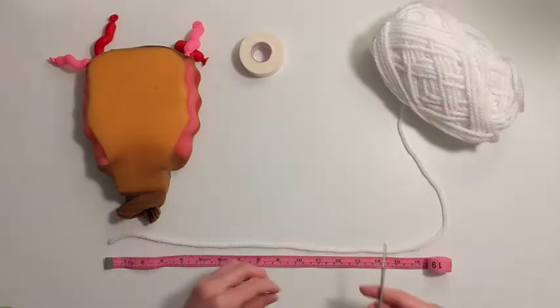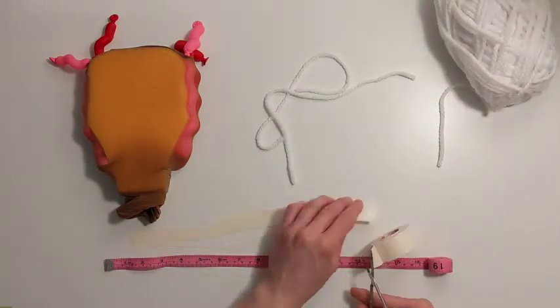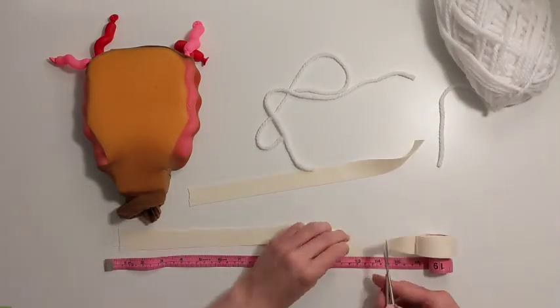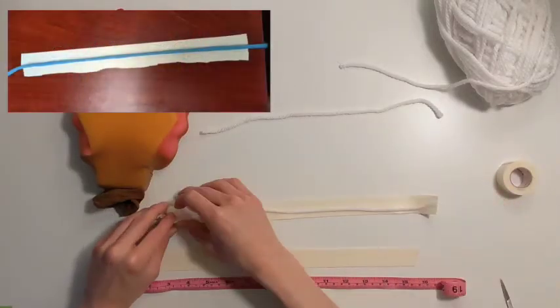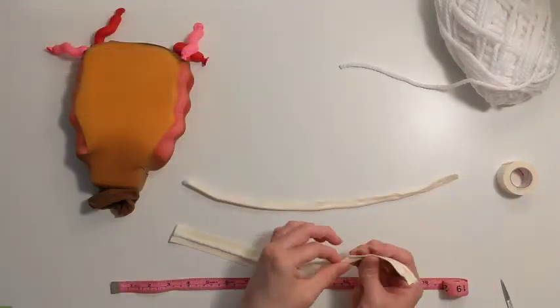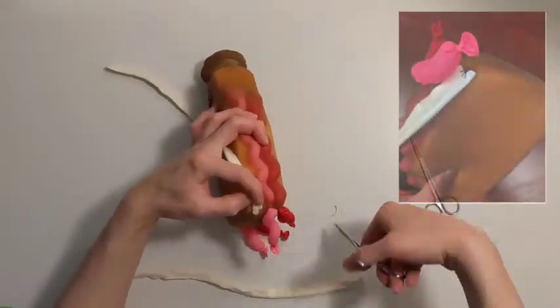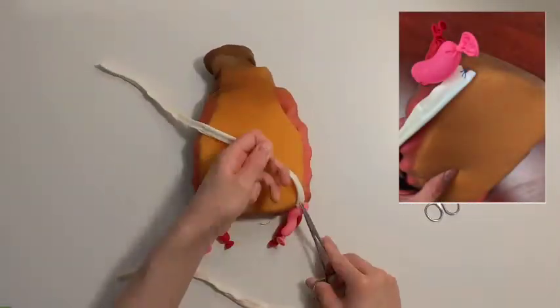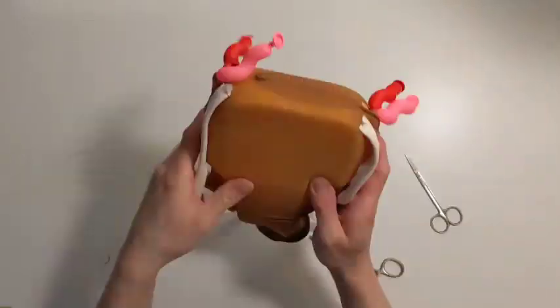To develop the round ligaments, cut 2 pieces of yarn around 33 centimeters long. Then cut 2 pieces of microfoam tape just over 33 centimeters. Place the yarn in the middle of the microfoam tape and fold the tape over the yarn. Then attach the round ligament to the uterus just anterior to the exit point of the balloons. It may be easier to attach the round ligament to the uterine cornua with a figure-of-8 suture or a needle and thread.